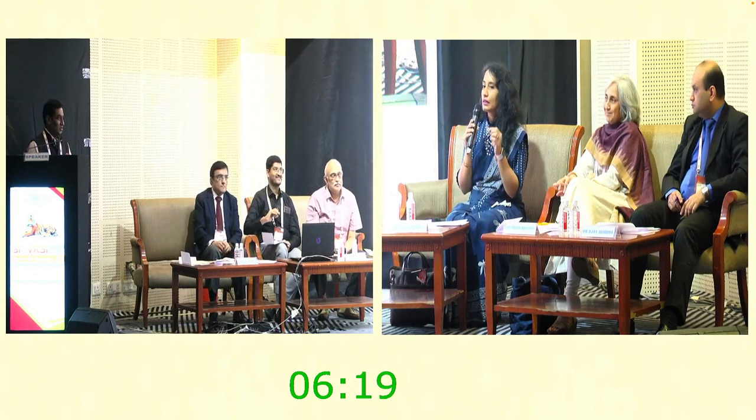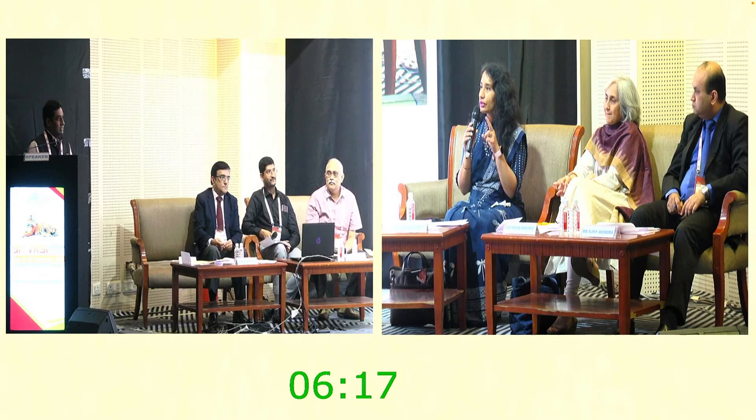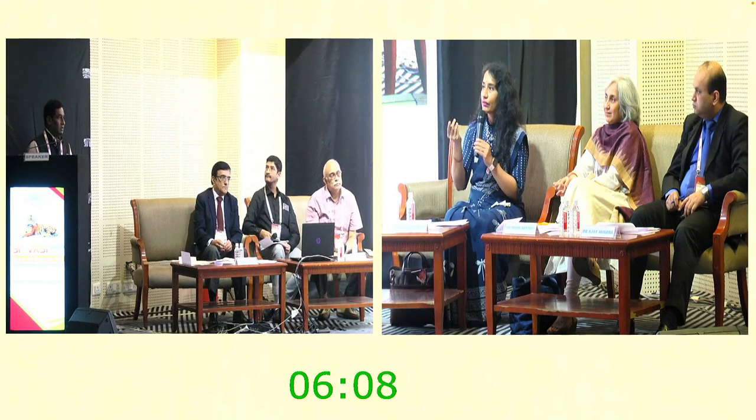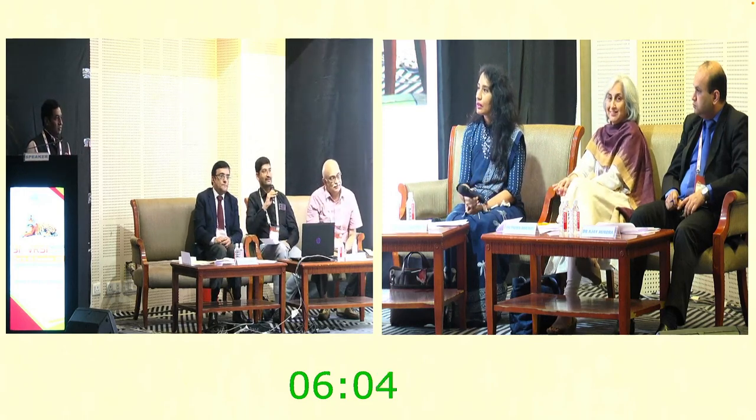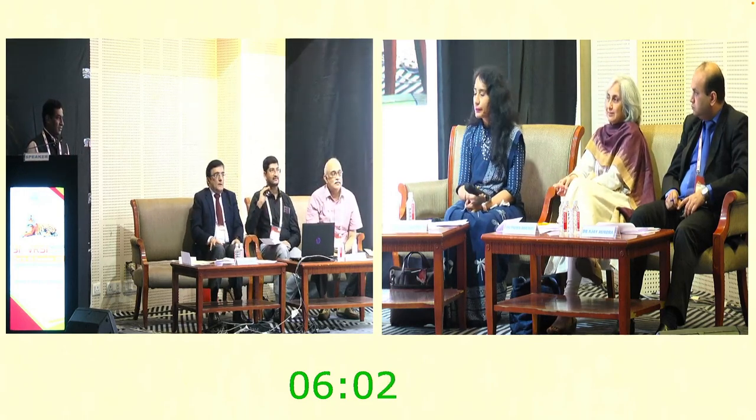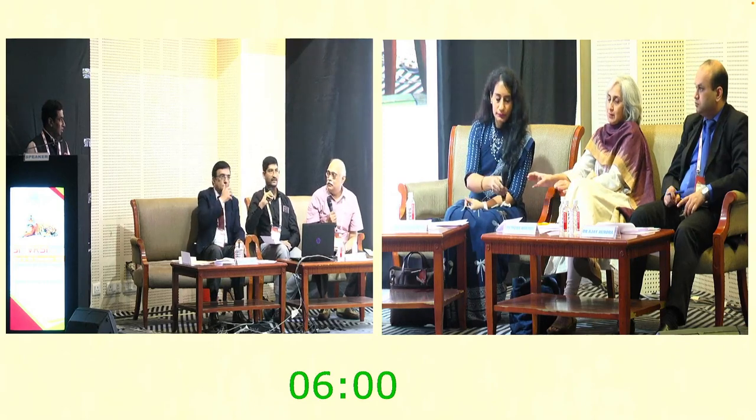But if I remember correctly, you had mentioned that during preparation, you would cut off the bevel, isn't it? So there is no real way in which you can put bevel up or bevel down, isn't it? No, no, that is a cover, a sleeve, madam. It's a guide.